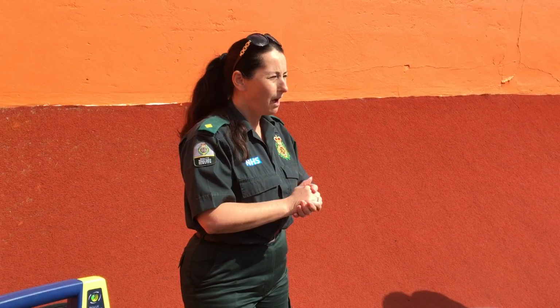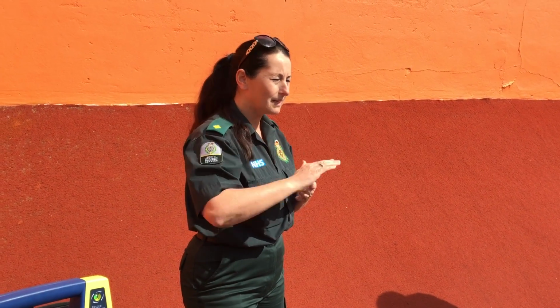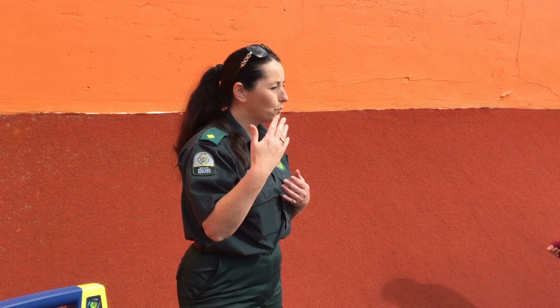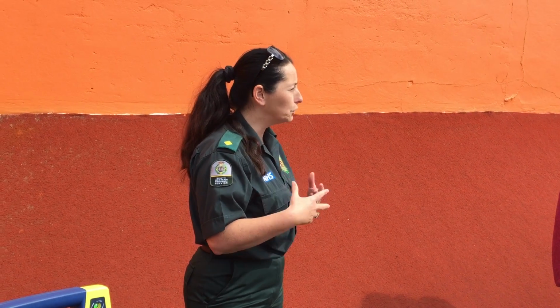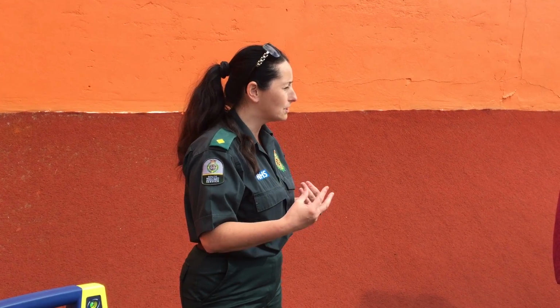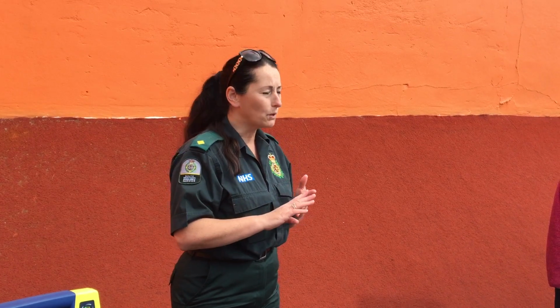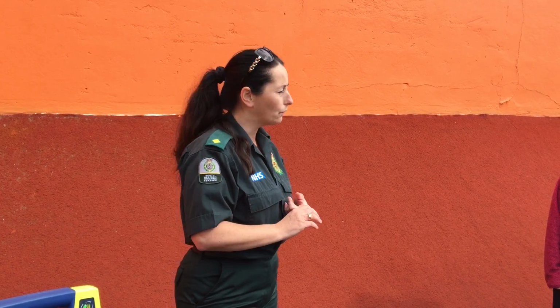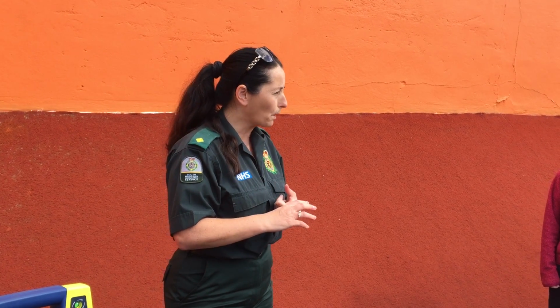So in any emergency that anybody would go to, whether it be the ambulance service or yourselves, say somebody has collapsed in the kitchen, in the cafe over there, the first thing you're going to do before you walk into that area is check to see if it's safe for you to go in and deal with that situation. There are steps 1, 2, 3. Step 1, if there's one person on the floor, you need to risk assess it and make sure it's safe to approach.